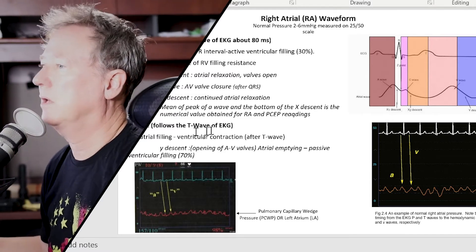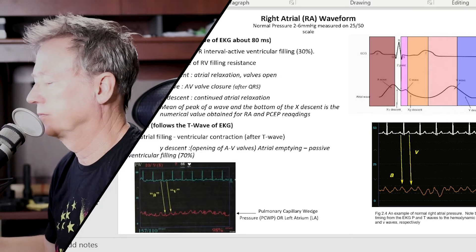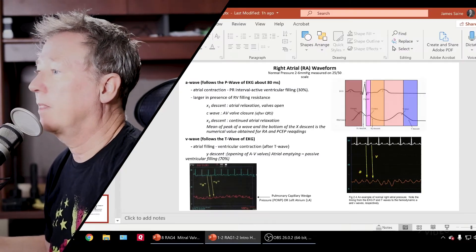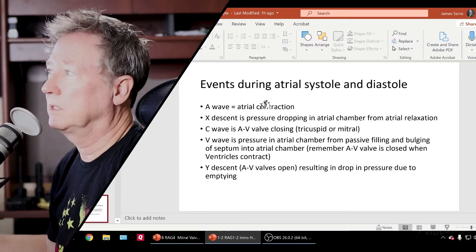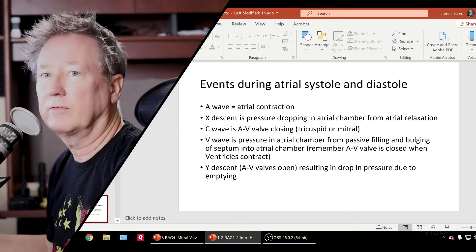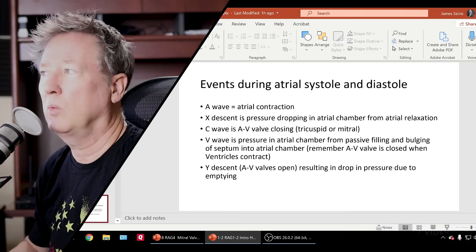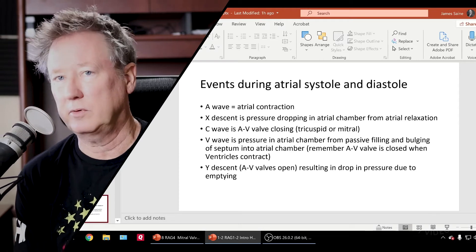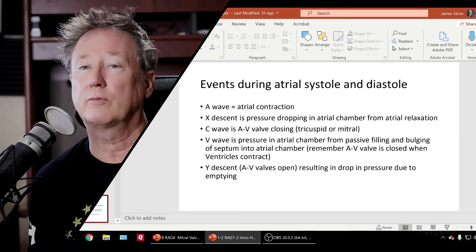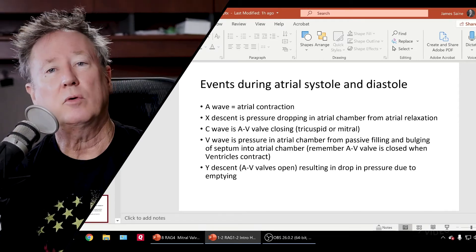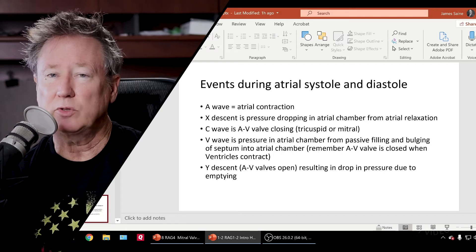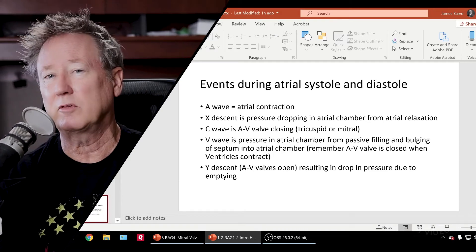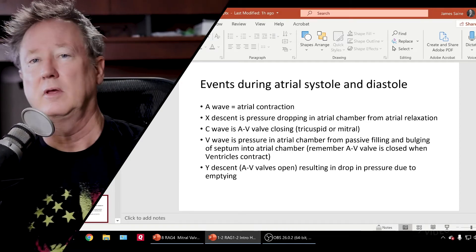Let's take a look at a wedge. First, before we jump into the wedge — the components of atrial systole and diastole are not exactly the same as ventricular systole and diastole.